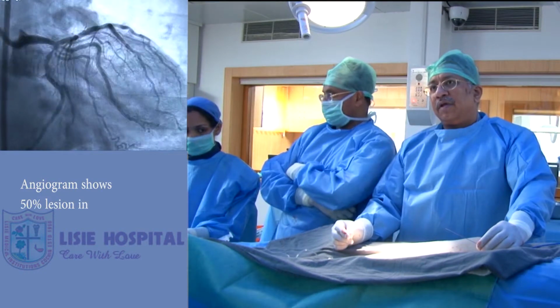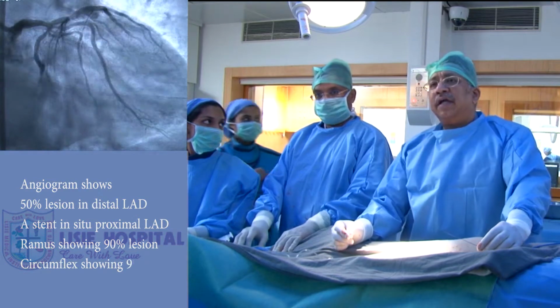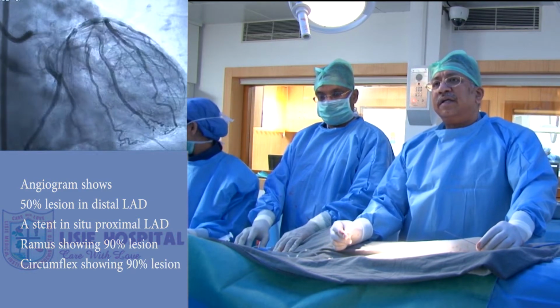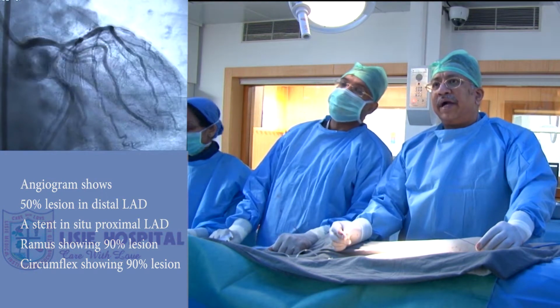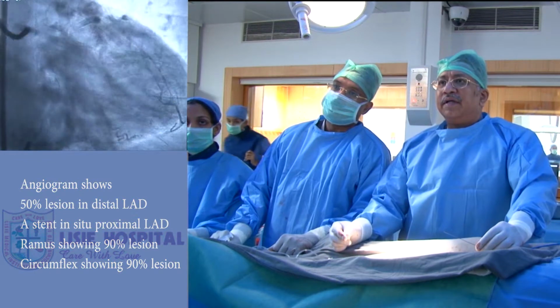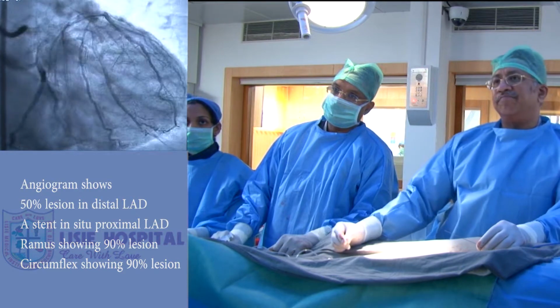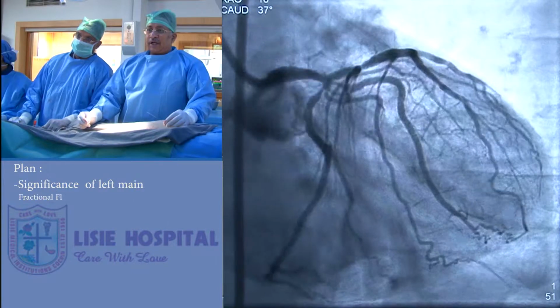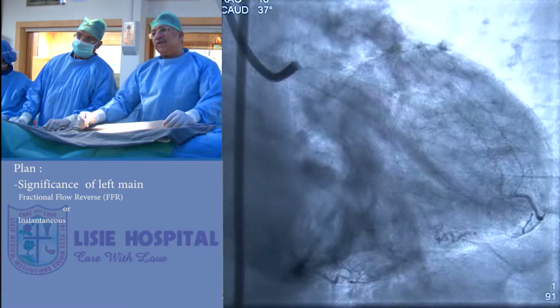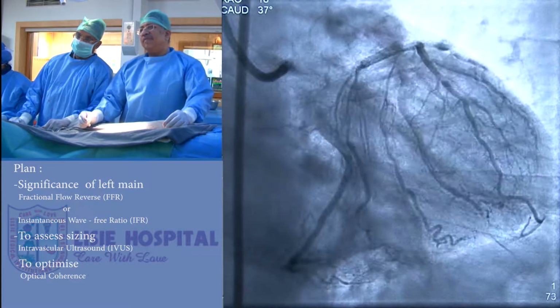Now this is what the angiogram shows. There is a distal LAD lesion. I would think it's around 50%, and there is a stent in the proximal LAD with a minor late loss there. There is a ramus coming, which has a 90% lesion, and a circumflex that has 90%. There are 2 other small vessels in between also that have tight disease. So what we are first planning to do is to find out if that left main to LAD is truly significant. Let's see the next view.